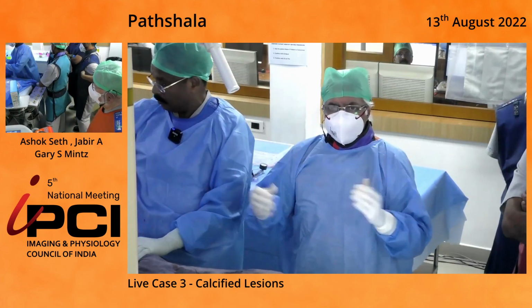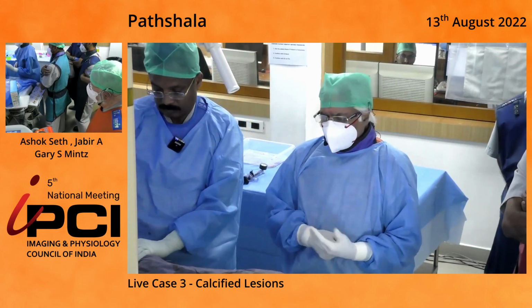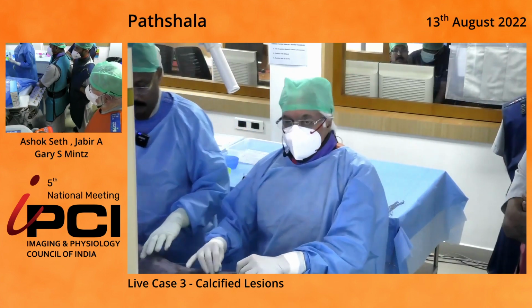And that's because the tissue would have absorbed it. For me, the first step would then have to be remove the tissue and then get an IVL. Otherwise, IVL would be less effective.